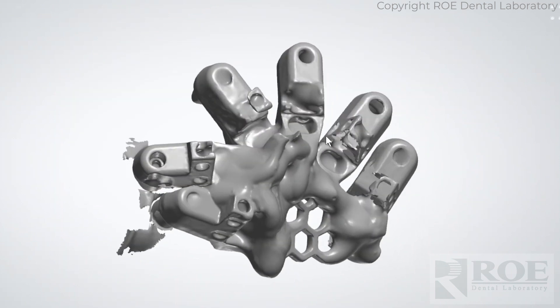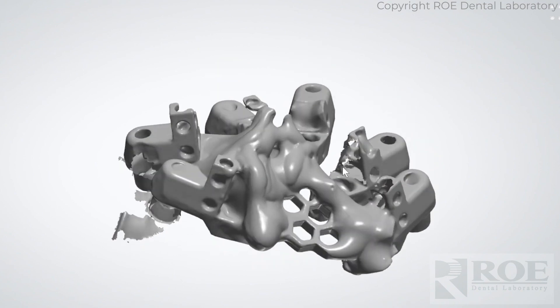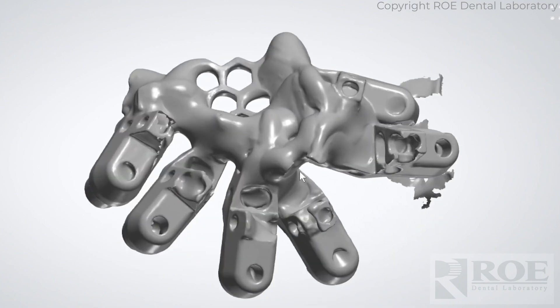Then the doctor scanned it outside the mouth to get a nice controlled scan of the OptiSplint luted.